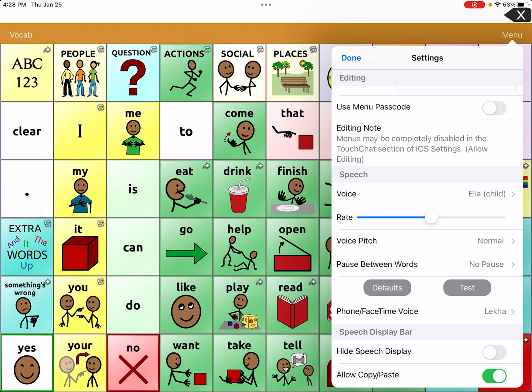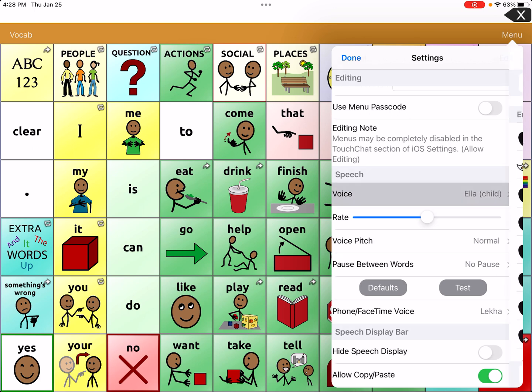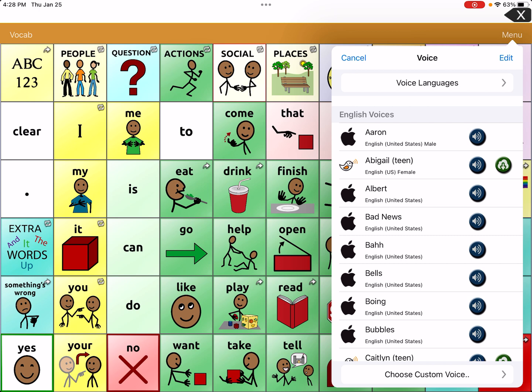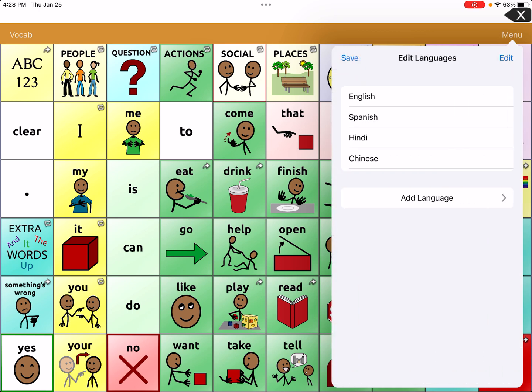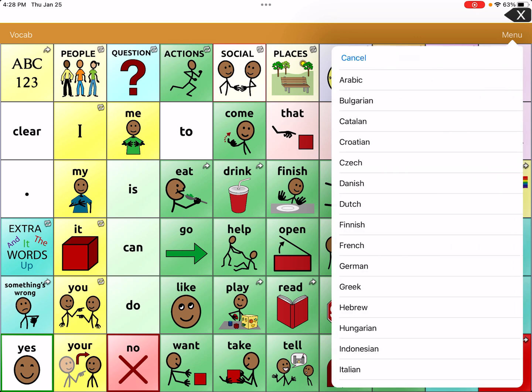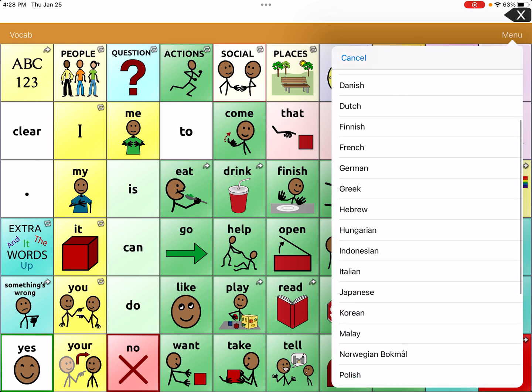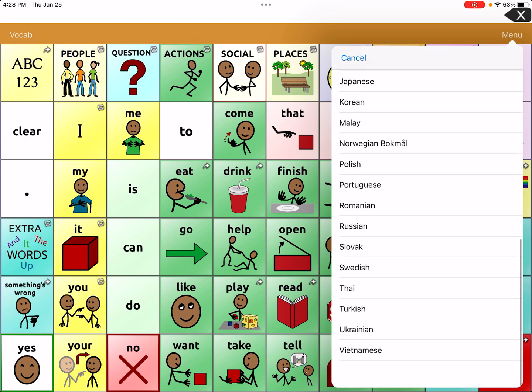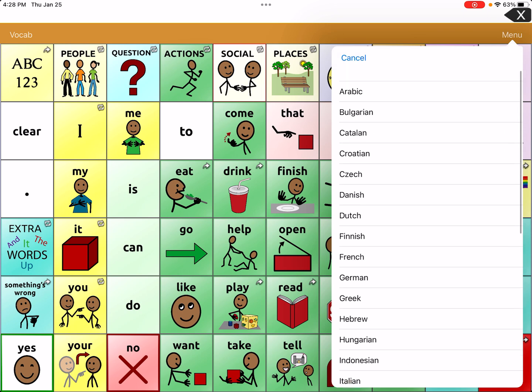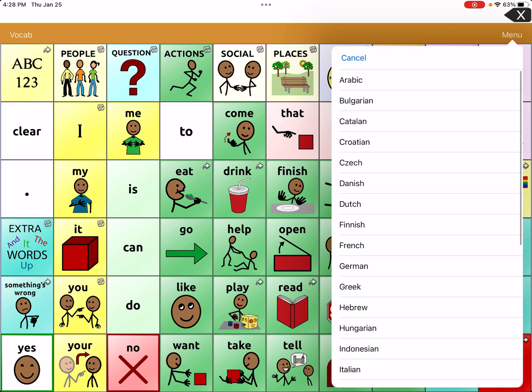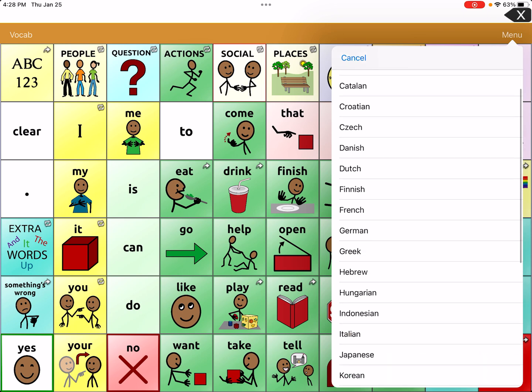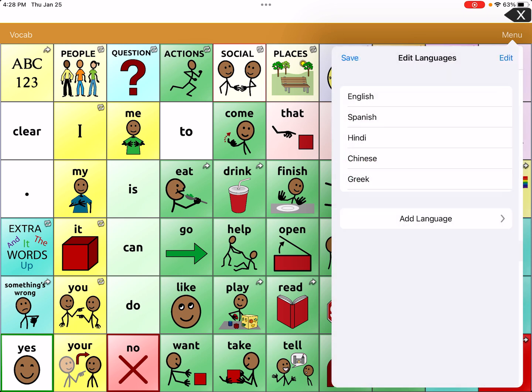Right now mine's set to Ella, but when I click here, I can see on the top it says Voice Languages. There are some languages that I've added, but if you hit Add and you don't see the language you speak, you can scroll and see if they have your language there and you can add one in, just like that.